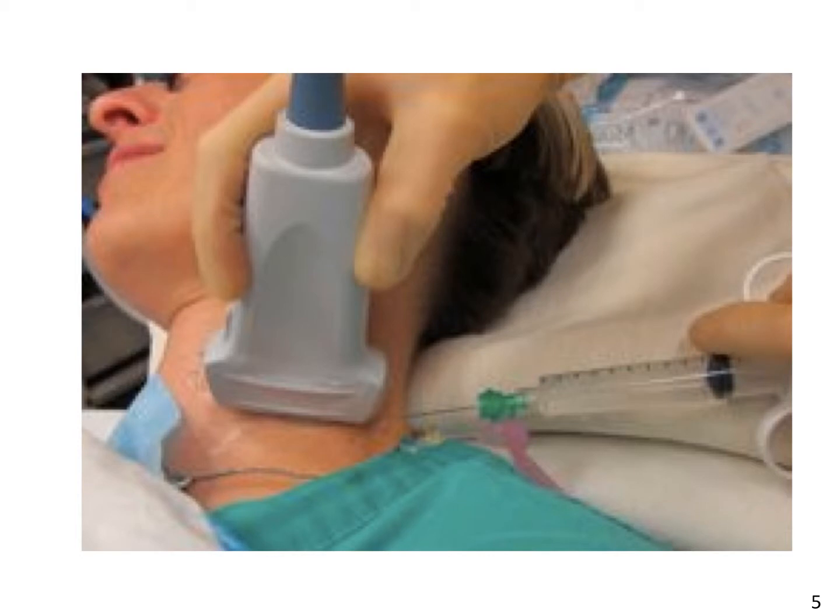Once you have identified all the relevant anatomy, you can set up to perform the nerve block procedure. The ideal positioning of the patient is sitting up with the provider standing behind the patient. The ultrasound can be positioned on the opposite side of the patient for the most convenient visualization. The needle is inserted just lateral to the edge of the probe, and using an in-plane technique, this is advanced under direct ultrasound guidance.